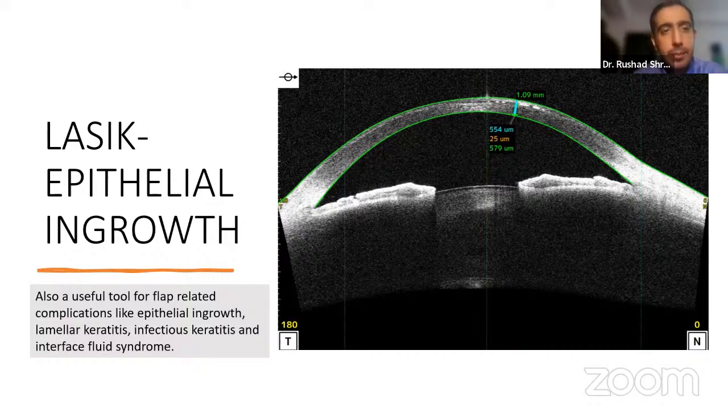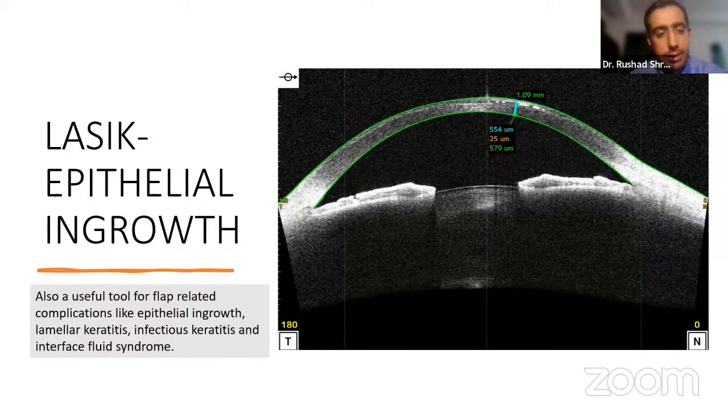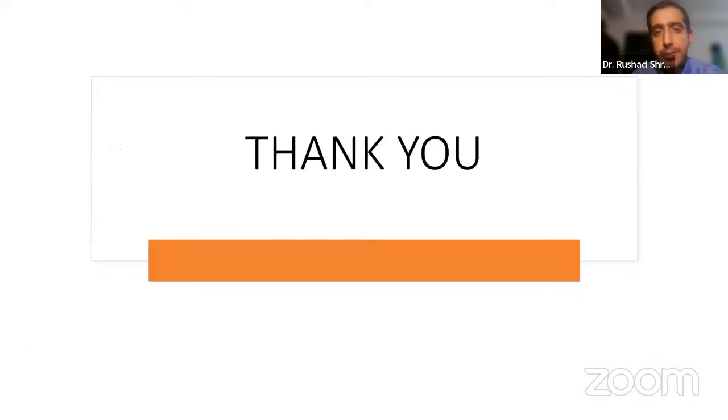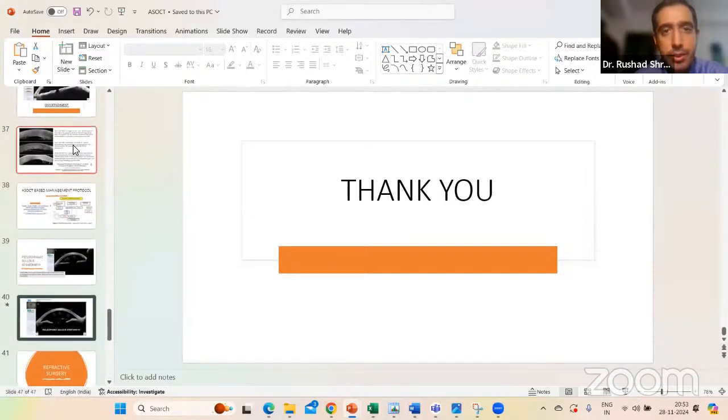Another area where it helps in LASIK is pressure-induced stromal keratitis, where you get a hyporeflective pocket in the corneal stroma, which tells us that there's high pressure, because these patients are generally myopes, and with steroids, they do get high pressure. So with that, I would like to end my presentation. Thank you so much. And I would be free to take any questions if there are.